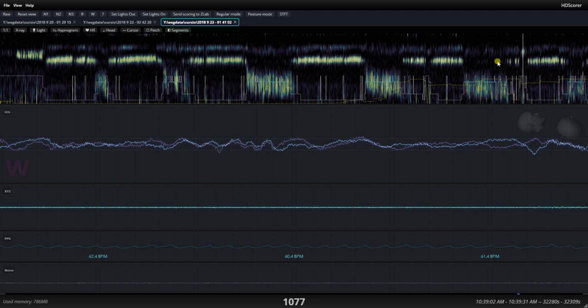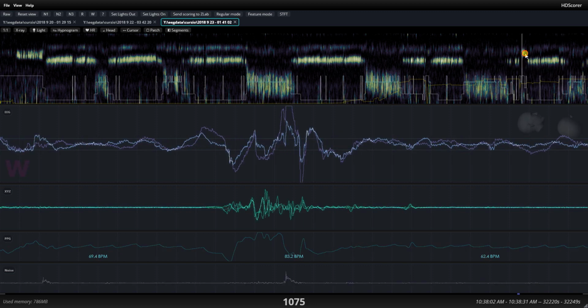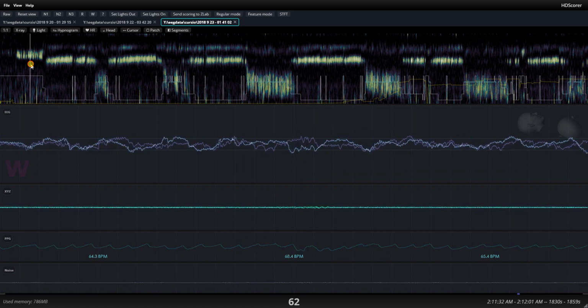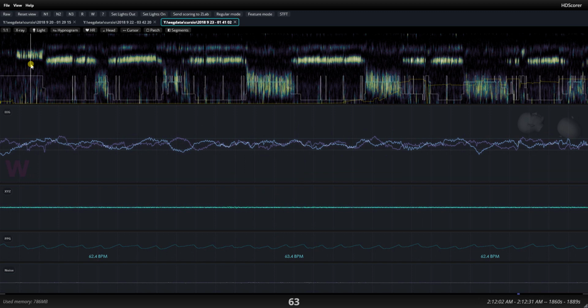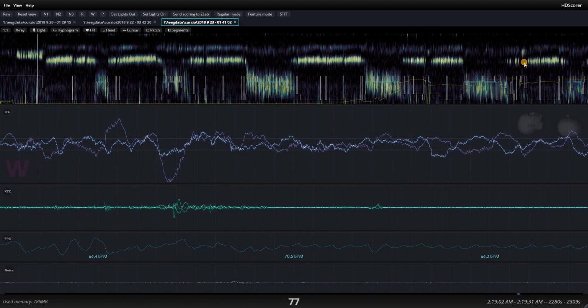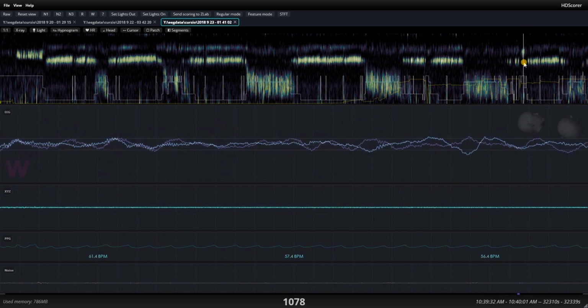I also want to direct your attention towards the fact that alpha that occurs during an awakening and the alpha that occurs prior to sleep, they look different. They might not even be the same type of brain process that generates them. I found that this is frequently the case regardless of the phenotype and the particular frequency at which alpha waves manifest themselves in a patient. But it does correspond to wake anyway, so they're correctly scored as wake.